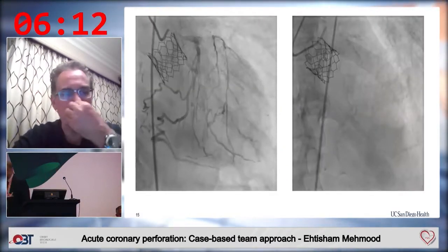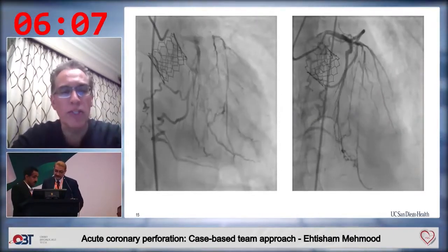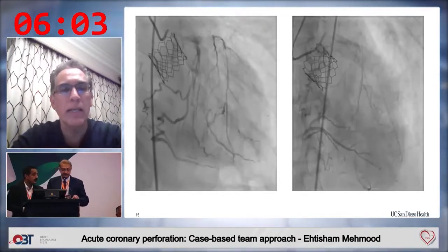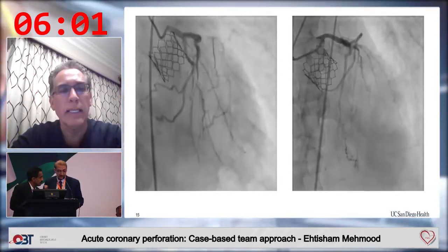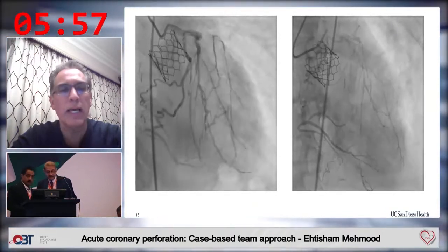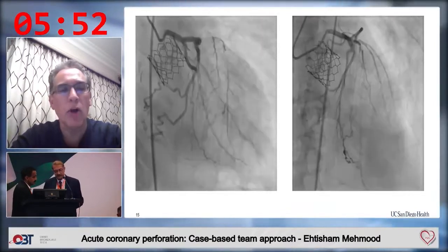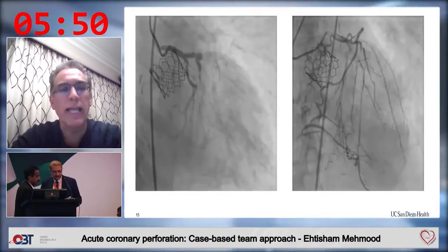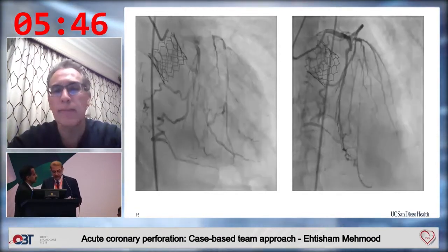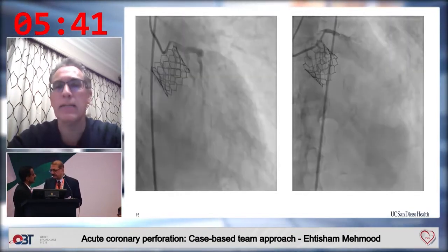On the left side, you see the TAVR valve is in place. There's an occluded RCA, but as I mentioned before, the inferior wall was dead and infarcted. The LAD is occluded, but you can see beyond the 2-centimeter occlusion, it recanalizes. And there were perforators. That's a very large first septal perforator that provides retrograde collaterals to the distal LAD. So I'll leave this up a little bit because it's really important to study this.